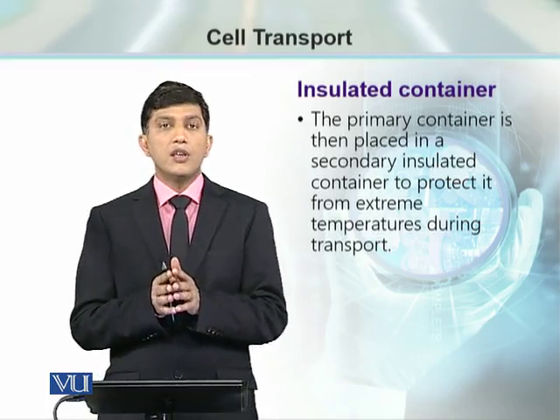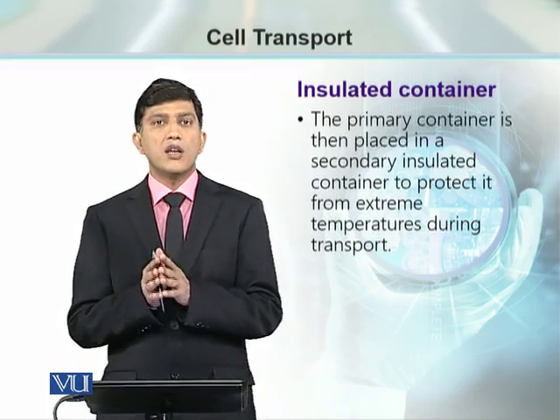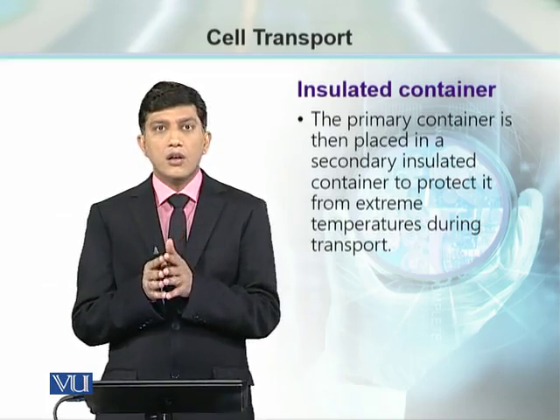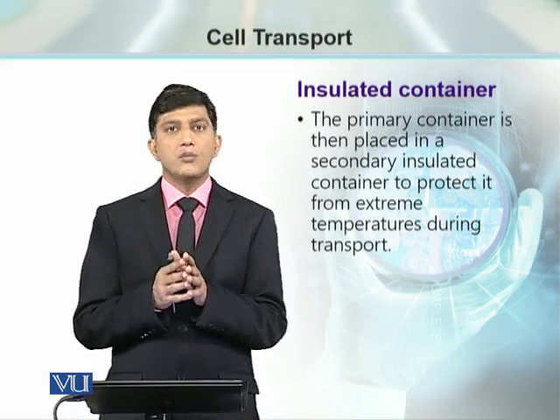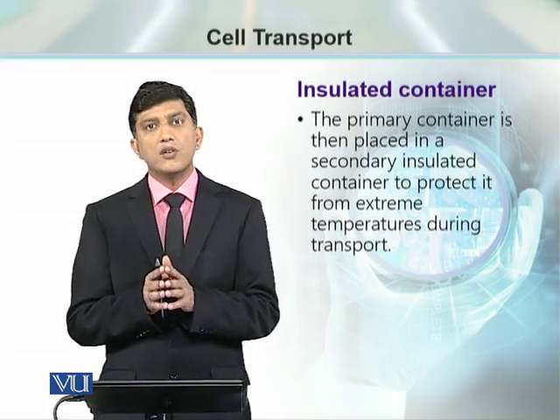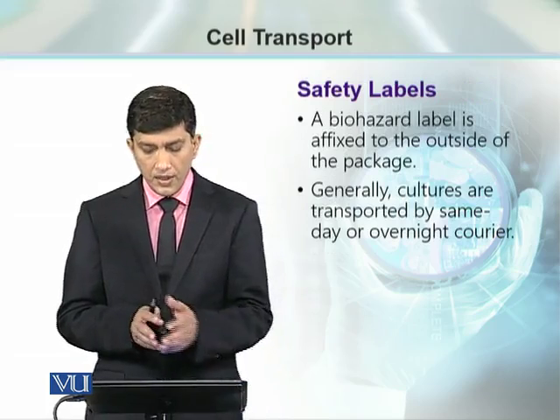After that, these sealed culture flasks are placed in an insulated container. An insulated container will maintain the temperature. It will not make it happen कि during high temperature अगर हम flask को transport कर रहे हैं और low temperature atmosphere में हम transport कर रहे हैं तो जो rate of evaporation है उसको minimize किया जा सके.